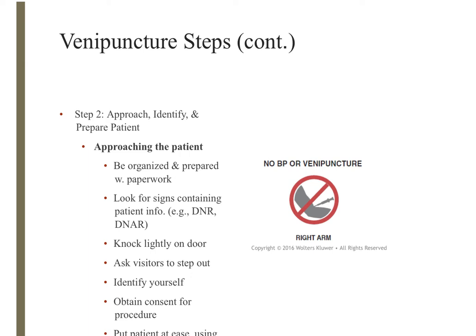Okay. You need to identify yourself. You need to obtain consent for the procedure. I need to get some blood from you today. Is that okay? You need to put the patient at ease using comforting, calming statements, okay? You need to ask if they have any questions.